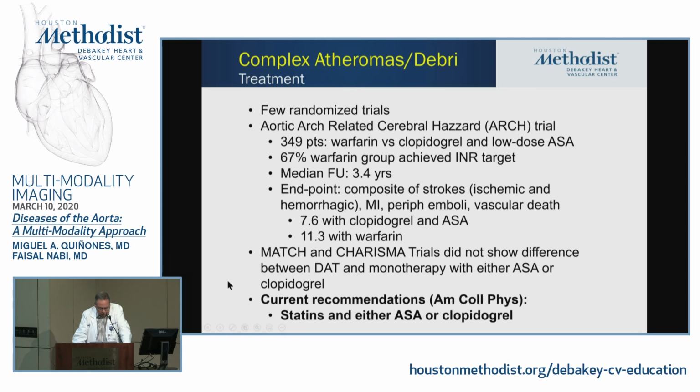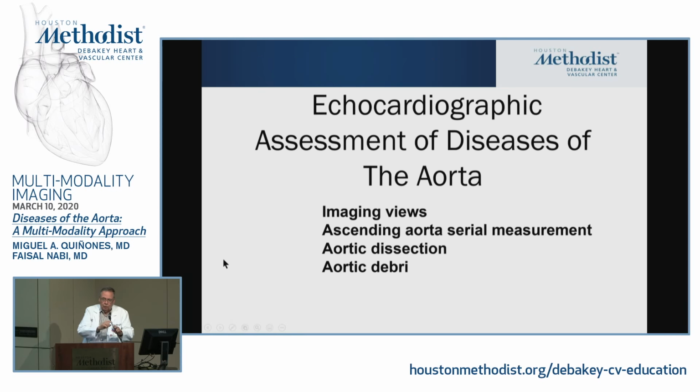So I hope this helps you a little bit because you guys are going to finish your fellowship, you're going to go into practice, you don't know where you're going to land. And if you have access to what we have here, because we're blessed with everything here, certainly CT will be what you'll be using the most of the time. CMR, you'll be using quite often, I would say, in dissections, particularly follow-up to look at the dynamic behavior. And echocardiography quite often will be the very first thing that will come in your eye when you're doing a routine echo and you pick up asymptomatic patients with aneurysm. So I think it's good to have a good knowledge of all three.